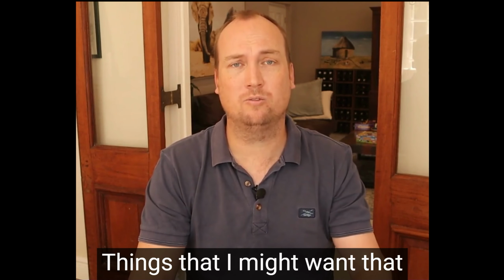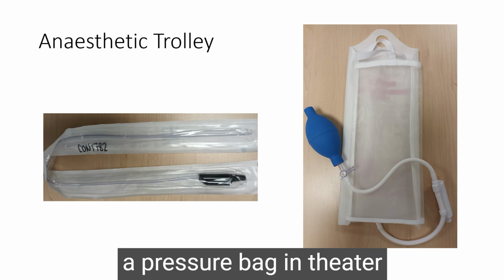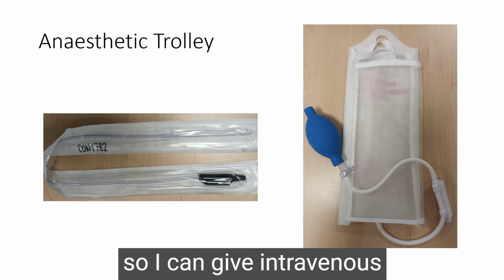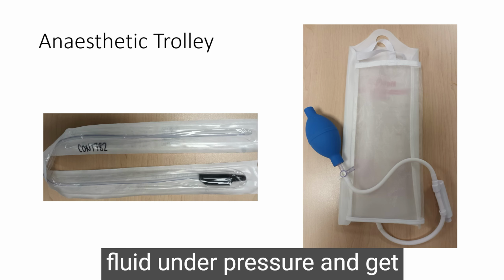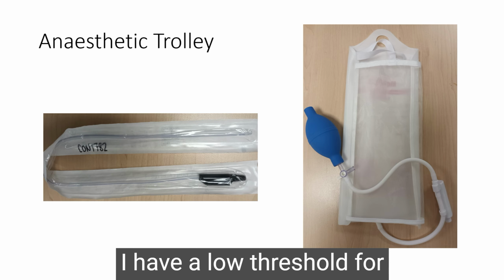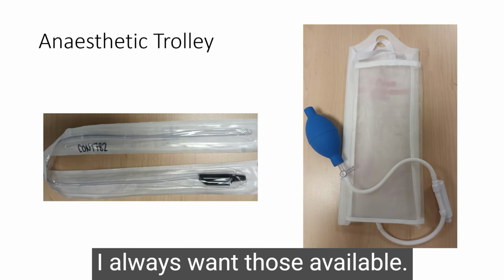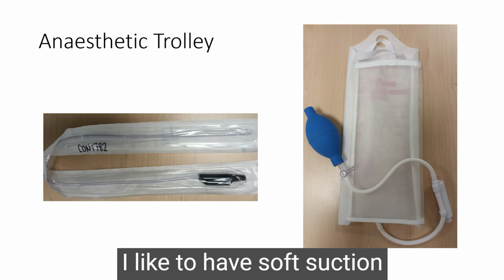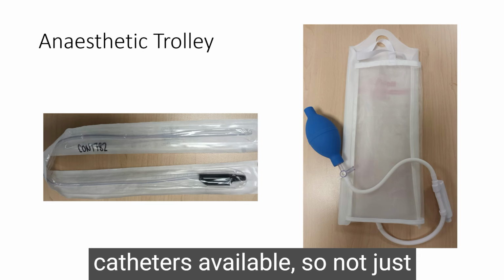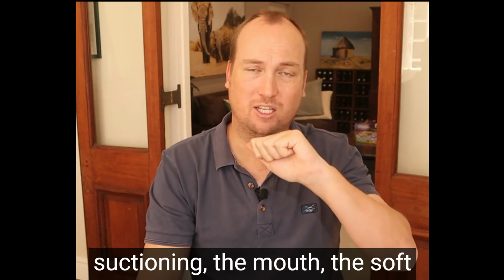Things that I might want that other anaesthetists might not want is I always want a pressure bag in theatre, so I can give intravenous fluid under pressure and get fluid faster into the patient. I have a low threshold for using temperature probes in theatre for my anesthesia, so I always want those available. I like to have soft suction catheters available, so not just the rigid suction catheters for suctioning the mouth.